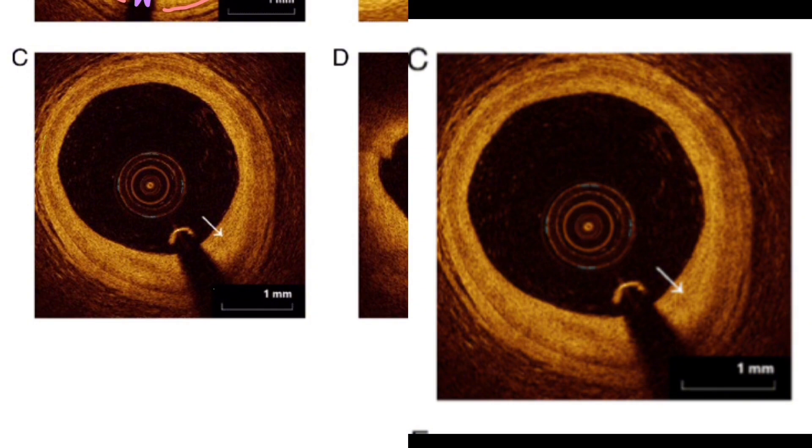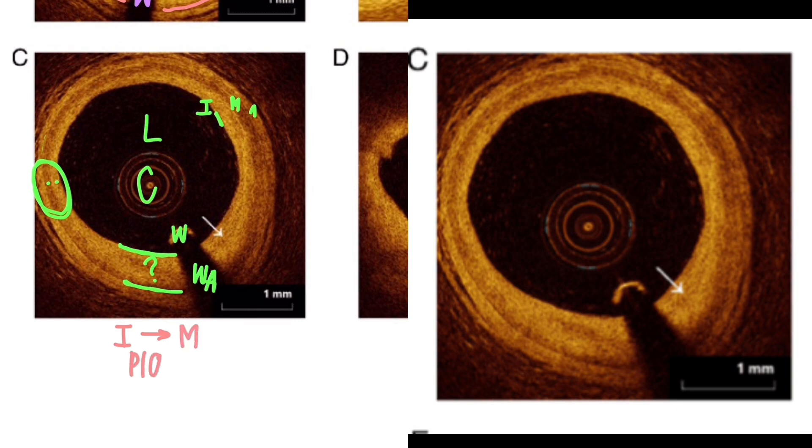Let's label this example starting from the center: catheter, wire artifact, lumen, intima where it starts, media, and then the adventitia which is still the yellow out there. Now if you look here you see one, two, three vessel layers clearly — but here not so much; it's a little hazy. What you're actually looking at is what plaque looks like on OCT. If this is the intima and this is the media — remember plaque develops between the intima and the media — all of this heterogeneous area is plaque. On OCT it just looks like a very thick intima. In a healthy segment the vessel layers are very close to each other, but if you're starting to see this thicker-looking intima, all of that yellow is soft plaque.